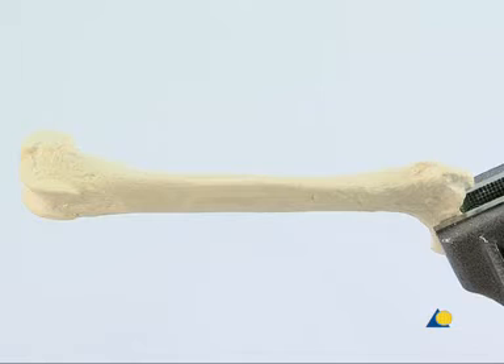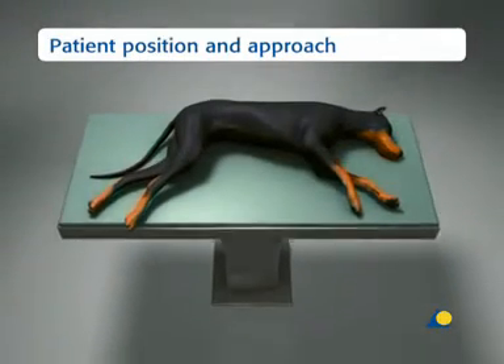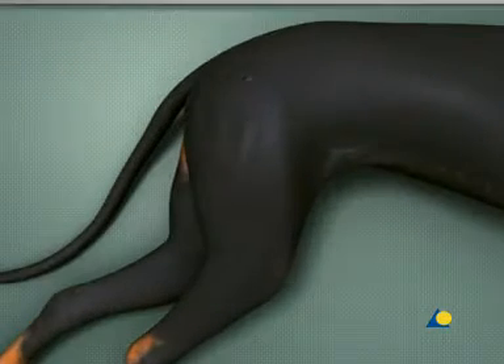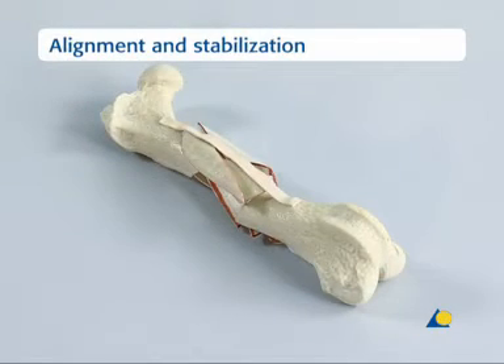An intact femur is used in this exercise in order to judge both the plate position against the landmarks and how much contouring is required. In a clinical case, a radiograph of the uninjured leg would be used. The patient is positioned in lateral recumbency on the operating table with the affected limb uppermost to allow a lateral approach to the femur. This is the bone model of the comminuted fracture of the femur.